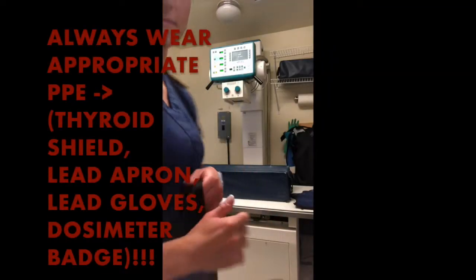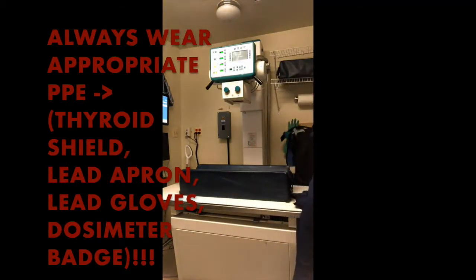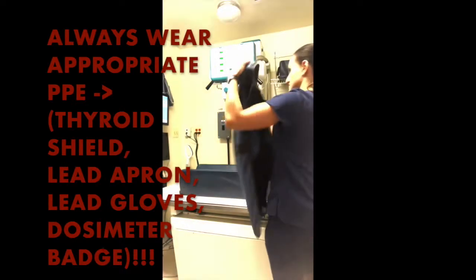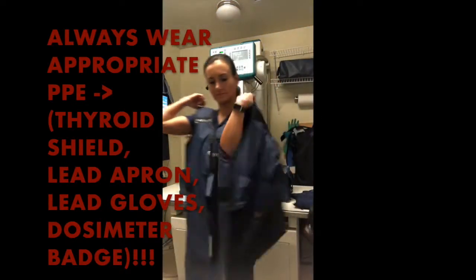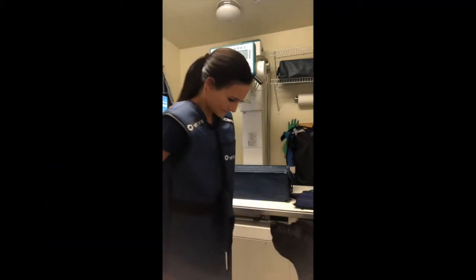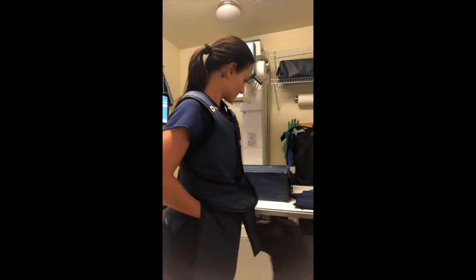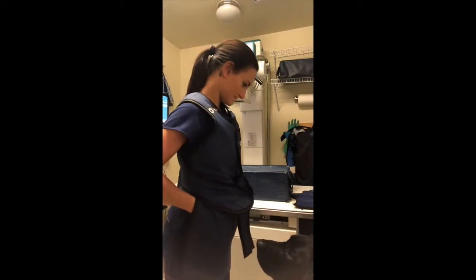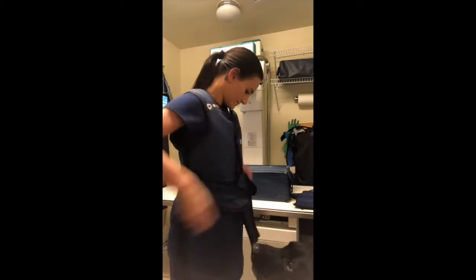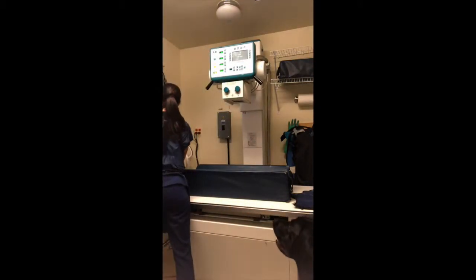For abdominal radiographs, measure at the thickest part of the TL junction. Center caudal to the 13th rib in the dog, or 2 to 3 finger breadths caudal to the 13th rib in the cat, including cranially from the T9 for the VD view and the T7 for the lateral views, and caudally to the acetabulum. For positive contrast studies, make sure you set your kVp about 6 to 8 kVp higher.